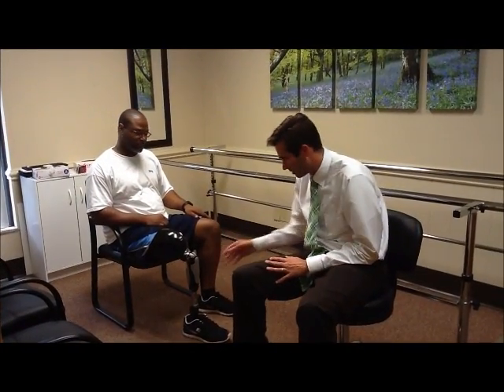Some of the special features of the Malk Knee include the way that it can recover from a stumble — it's called stumble recovery. The knee has resistance if you are to trip. The knee will provide some resistance and allow you to catch your balance. Hopefully, that's the goal.